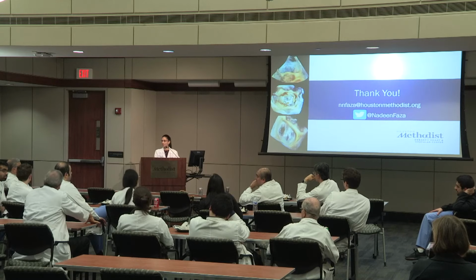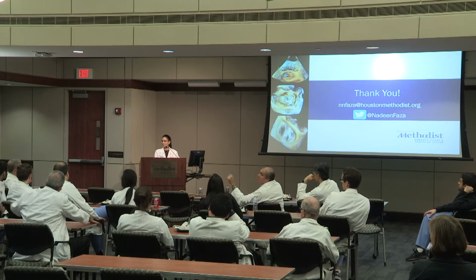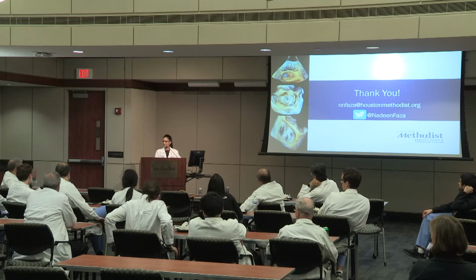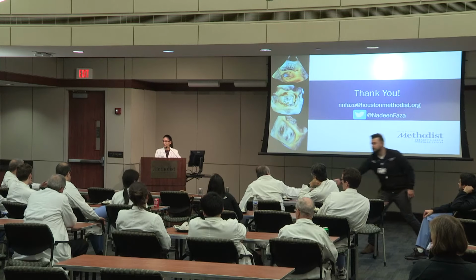Okay. Nadeen, that was really nice. Thank you. Are you using, I'm going to take just the mitral valve clip, residual mitral regurgitation color, pulse Doppler in the pulmonary vein, certainly very easy and very helpful, and prognostically looks like important. But for the residual MR, some labs are using 3D vena contracta, just like flipping it, measuring it and just have a feel for it. Are you using that routinely when you see it or not?